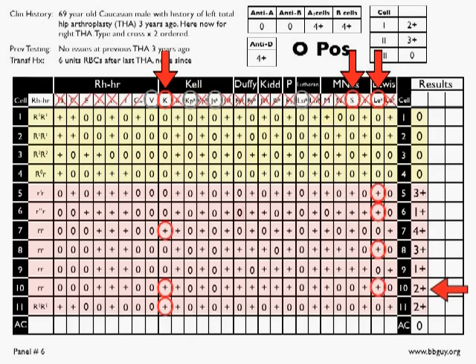So let's try our other combination, which is the combination of anti-big K and anti-big S. Well, you're probably guessing that this one is going to work, and it does. So double dose of big S in cell 5 with a 3+, single dose in cell 6 with a 1+, both big K and big S in cell 7, that gives you a strong 4+. Only cell 8 is basically the same as cell 5 in terms of the antigens that are present. Cell 9 is the same as cell 6. And finally, cells 10 and 11 are sitting down there by themselves with only big K antigen present, and they're giving you the kind of reactions that you would expect.